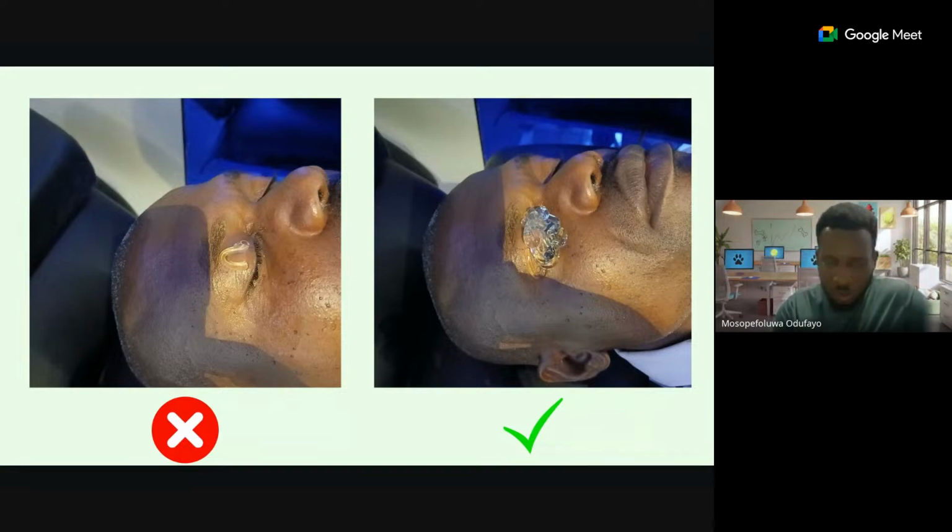And obviously, it doesn't get there, except if one is actually trying to be incredibly wicked. Very importantly, number two, apart from causing pain and discomfort, if you apply too much pressure on the eyelid, that pressure is transmitted to the globe.